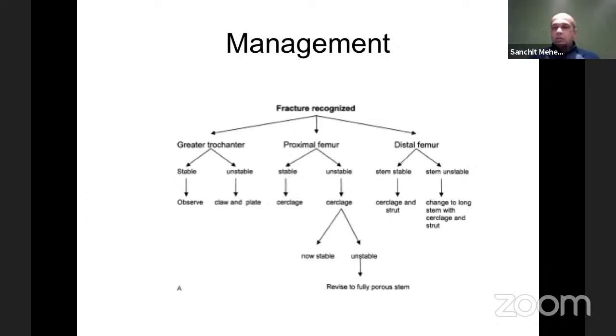With the distal femur, again, you have 2 variables. Is the stem stable? So it's well below the stem, and you can put a cerclage, you can put a plate, depending on whether there's a knee replacement distally. If the stem is unstable, you have to bail out to a long stem. This is, again, like I said, based on the Vancouver philosophy. So you'll see that in the older papers and older classification systems, the allografts and strut grafts are mentioned quite frequently. Now, in most cases, you would replace that with a plate.